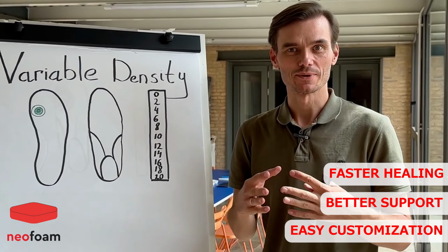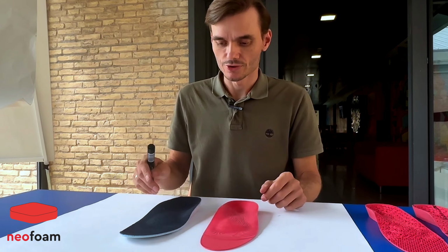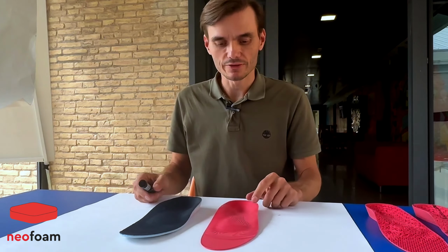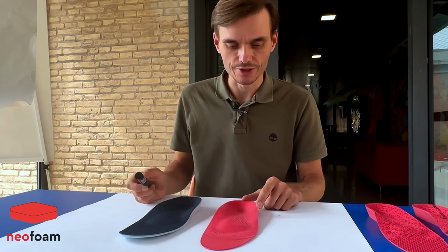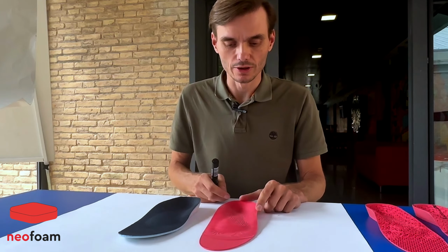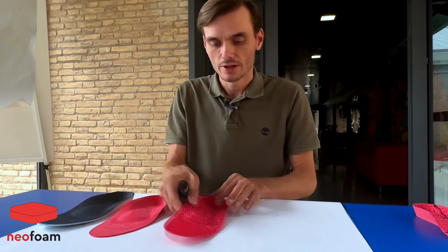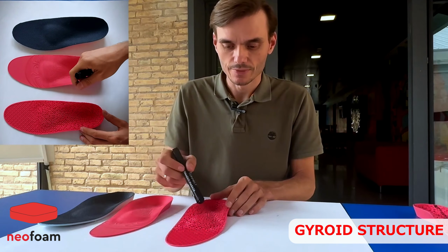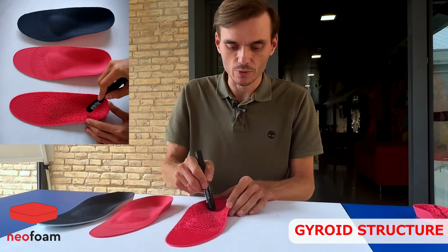Let's move to some examples. Here are two standard 3D printed insoles. One is with the special top cover and another one is just fully 3D printed with top layers. They're equally soft in all areas. Let's see what's inside them. Here is the gyroid structure. It's equal everywhere, so that's why the density is everywhere the same.